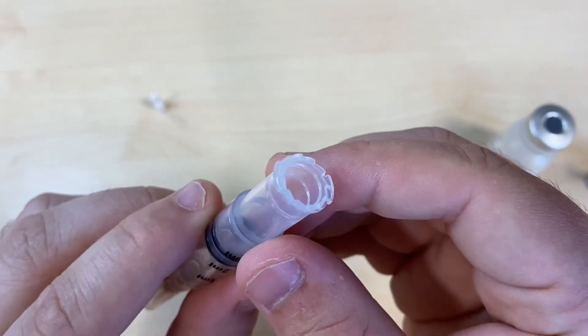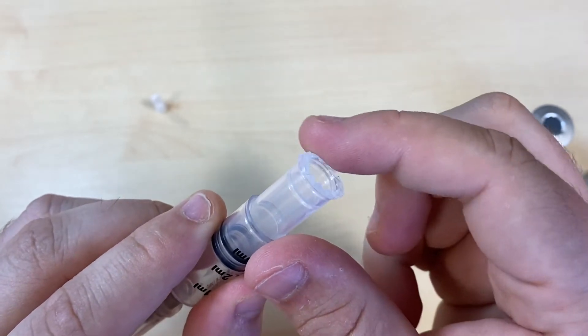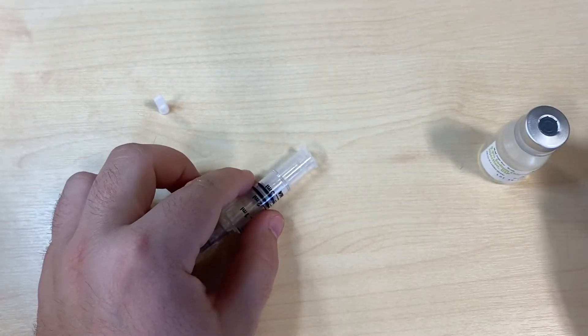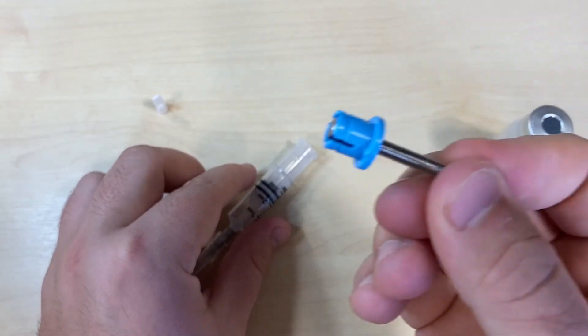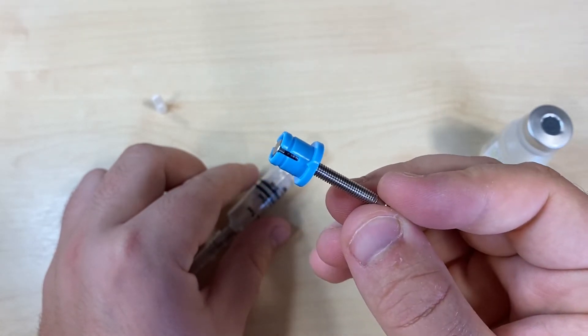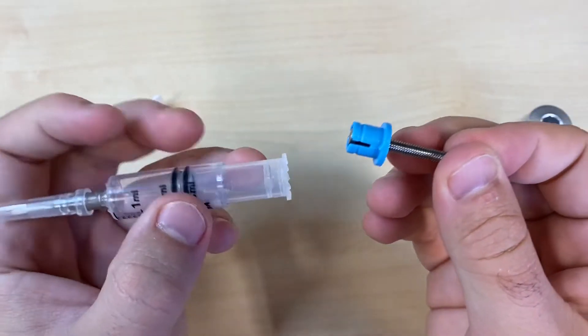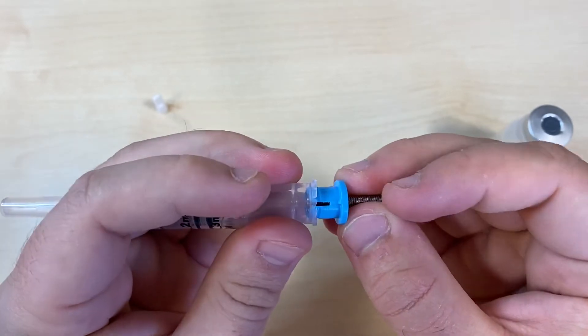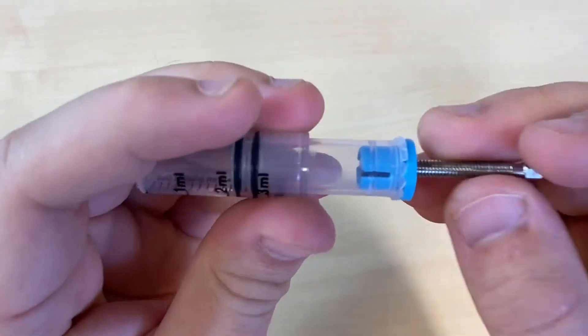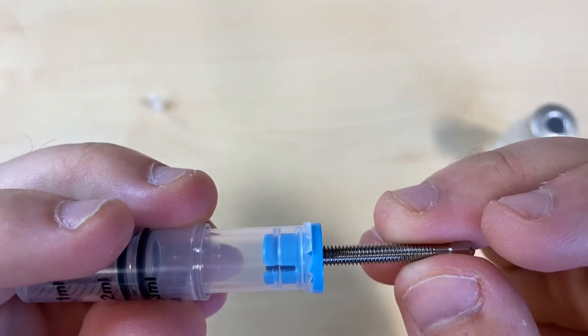There are teeth all around the base of the syringe. There are two corresponding teeth on either side of the linking screw. Clip the linking screw into the cartridge, making sure the teeth make a proper connection.